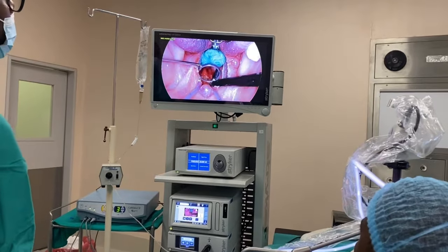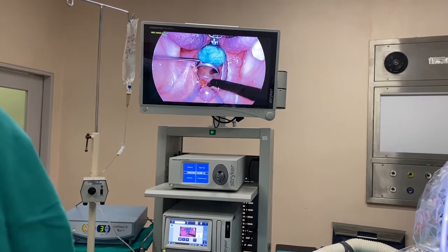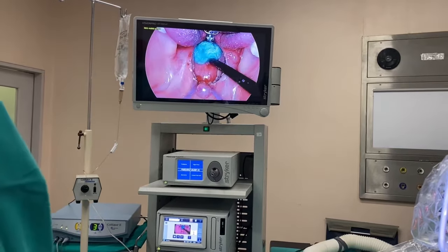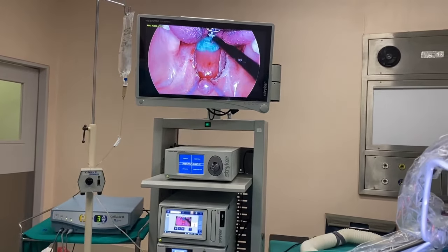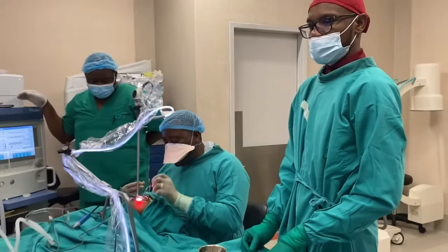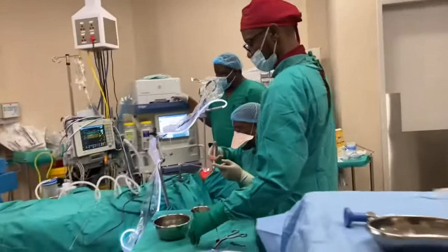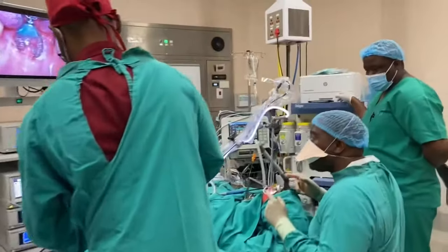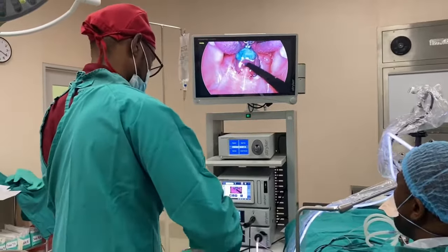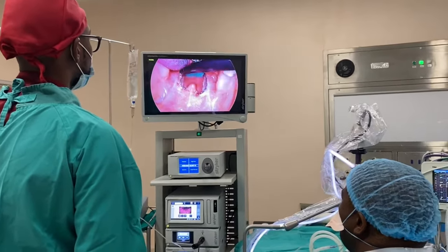You can see now the septum at the back — very nice. This child will breathe freely. You don't know the miracle that we are performing here. These children are not sleeping, the parents are not sleeping, they are frustrated at home. Can you imagine the child is snoring, and then at some point the child stops breathing? The parents exchange — one will sleep, one will watch over the baby so that the baby doesn't die. When the child stops breathing, they wake the baby up. You understand how frustrating that can be? When the father is sleeping, the baby is asleep, the mother is taken from their sleep because everyone is snoring.